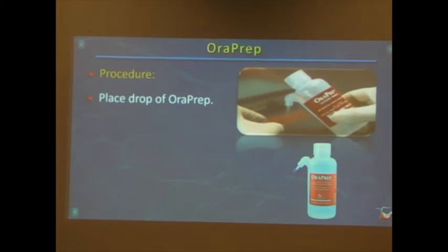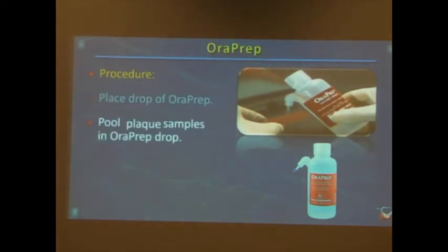So, place a drop of OraPrep on a new slide. Place your sample into the drop. In the old days, people would make separate drops for different teeth that they sampled. We now realize that it really doesn't make any difference. You can pool them all into one drop because regardless of any site being positive, you're going to have to treat the whole mouth as being infected anyway because the bacteria can easily translocate from one site to another.